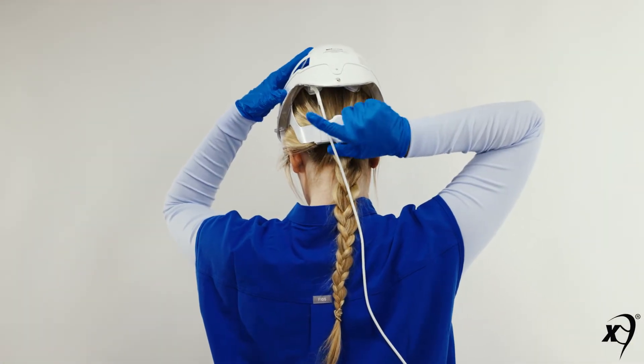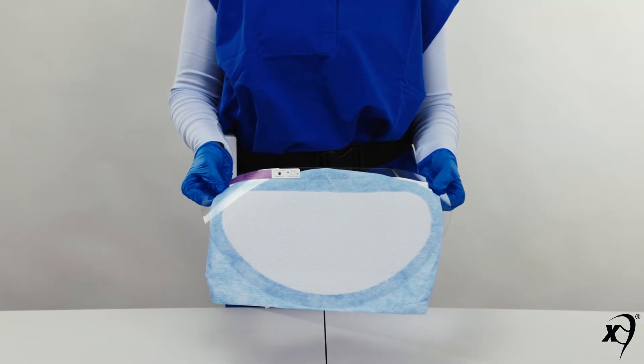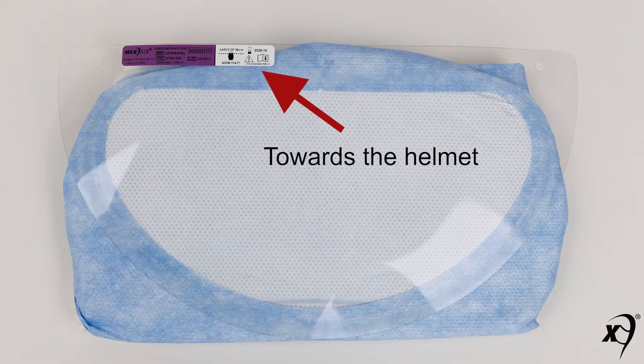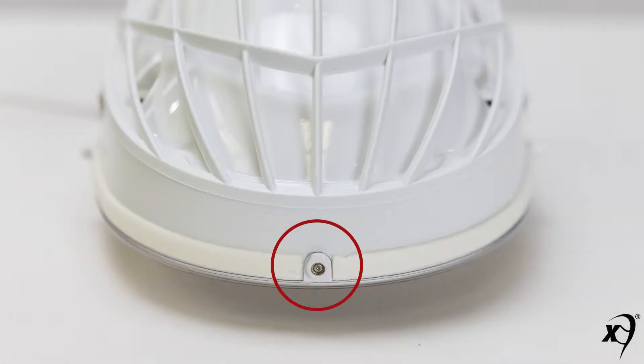Once the helmet is secured to the head, assemble the hood to the helmet. Make sure the hood label faces towards the helmet, and mount the lens front alignment hole to the helmet's front mounting adapter.